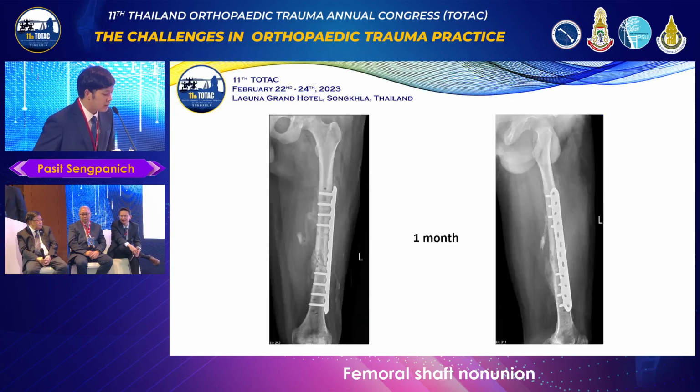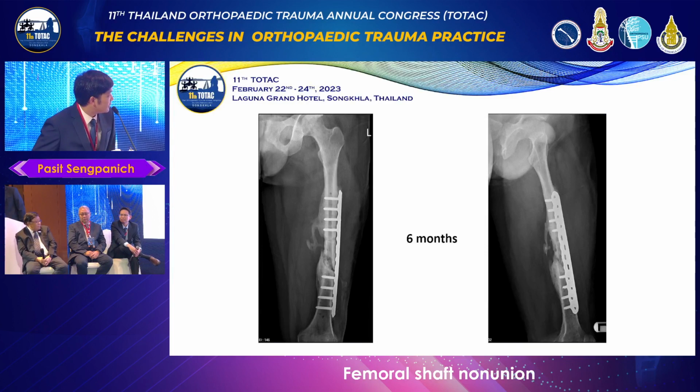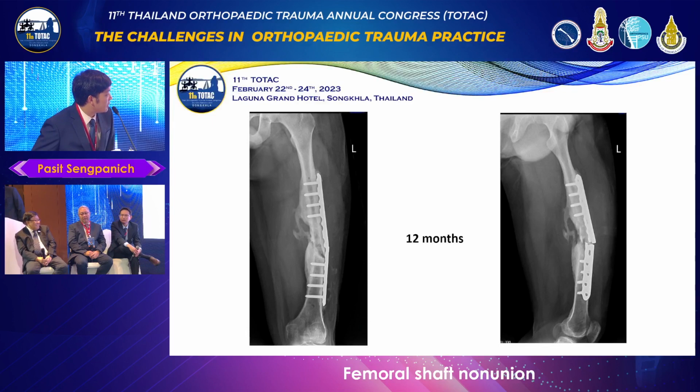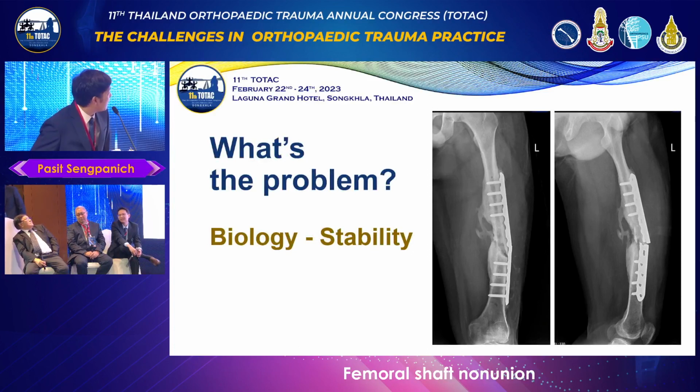And then they continued follow-up at 1 month, 6 months, 9 months, and 12 months. Unfortunately, we saw the plate was broken and the fracture was still not healed. Yeah. So now I will ask our panelists again, what do you think? What is the problem in this case? The stability or the biology, and what are your plans?